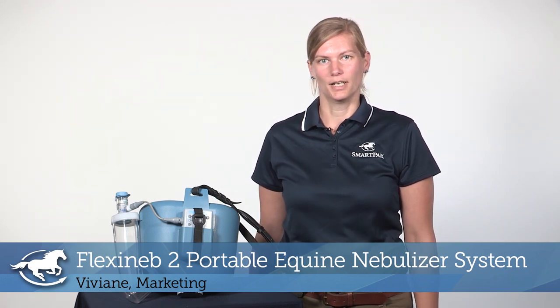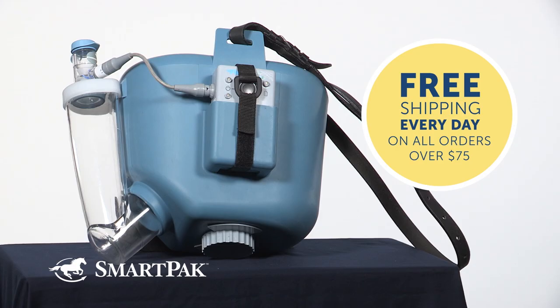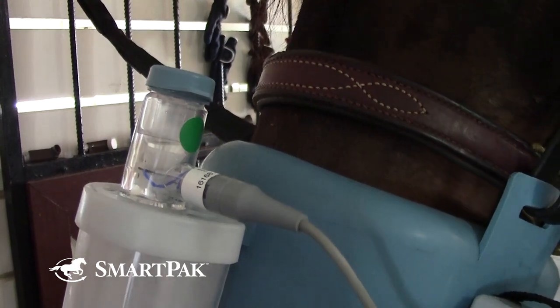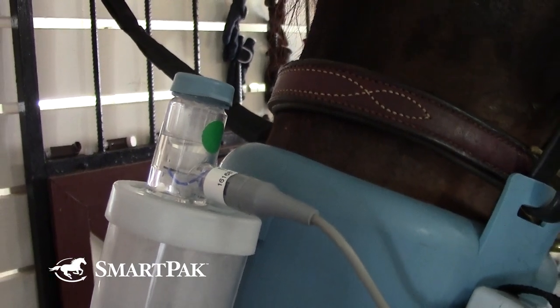Hi, I'm Vivian from Marketing, and today I'm reviewing the Flexinib II Portable Equine Nebulizer System. I currently use this nebulizer on two horses with inflammatory airway disease. I really like this product because they now get their medication in a very stress-free way, and it really saves me time and is super easy to use.